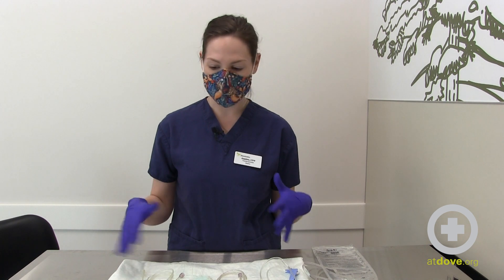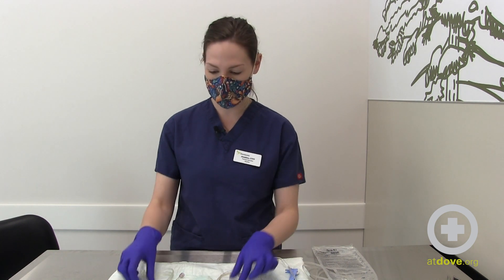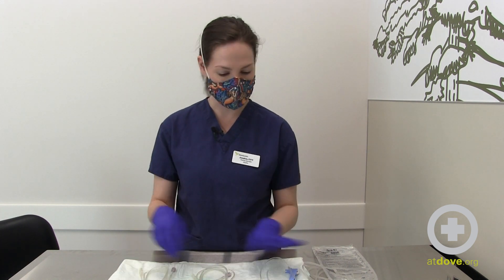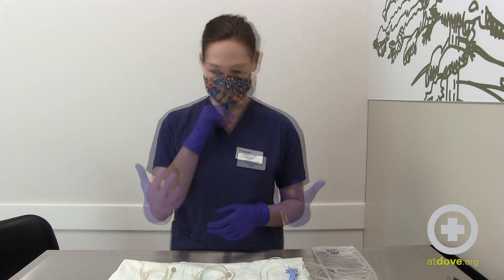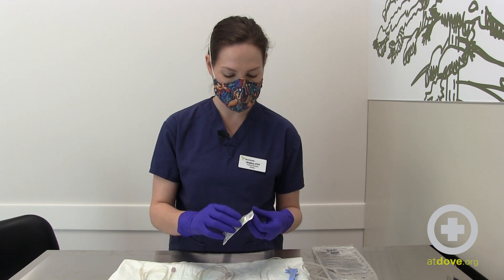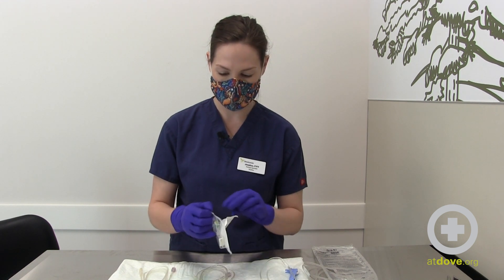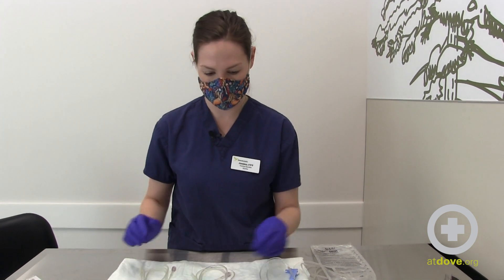For this setup I've grabbed supplies that we've already used, because right now there are some shortages on supplies, so please forgive my used extension sets and my partially used subcu fluid bag and drip set. You will be wearing gloves for this just to keep it more clean, so I'm going to open my T port and Y connector and have everything out and ready to go.